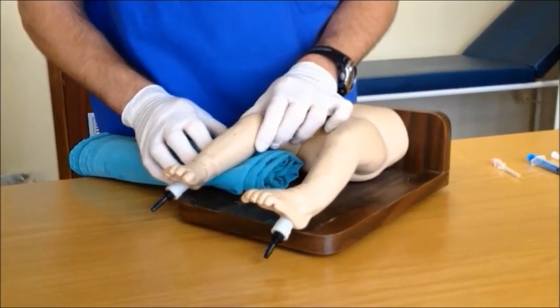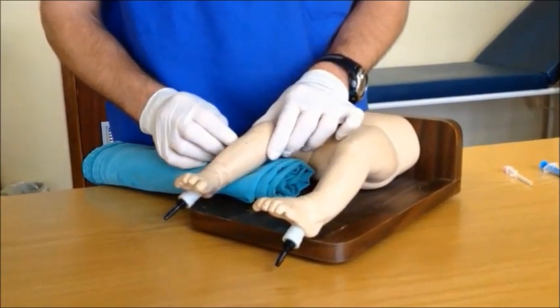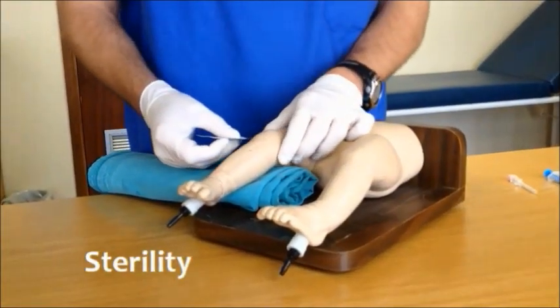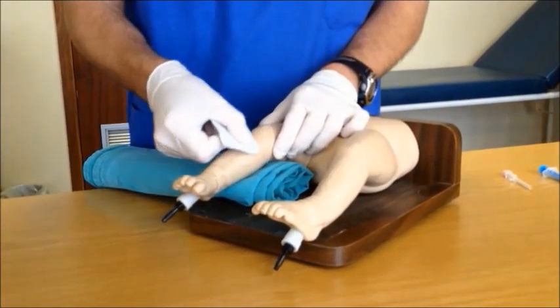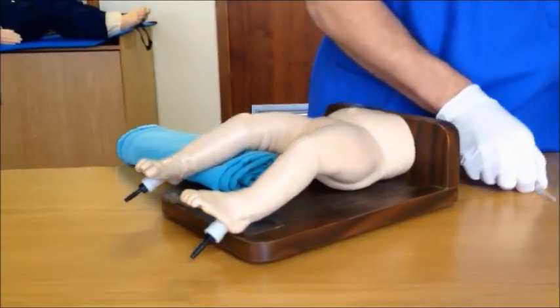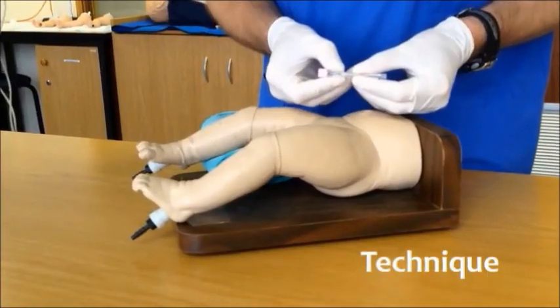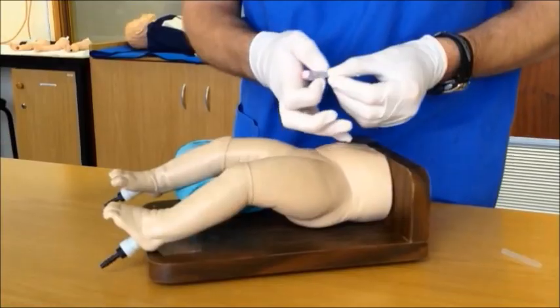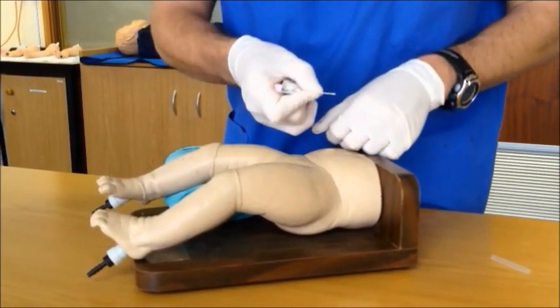Once the child is correctly positioned and the area of insertion has been identified, proceed with your procedure. Although this is an emergency and sterility is often not possible, attempt to be as clean as possible — an alcohol swab beneath the leg is the absolute minimum. To use the 18 gauge intraosseous needle, take off the sheath. We recommend holding it at the base of the index finger and then grabbing the needle between the index finger and thumb, giving you a firm but controlled grip.